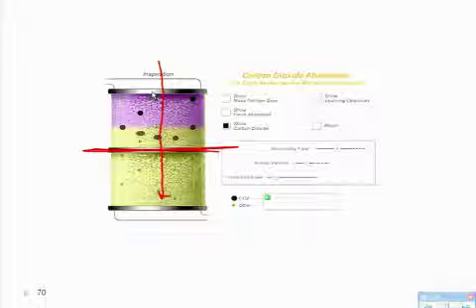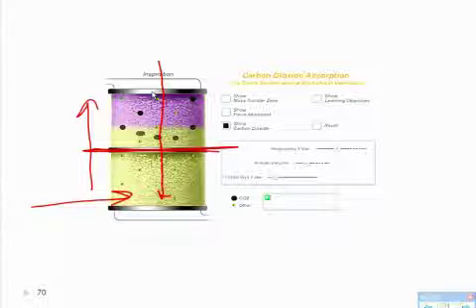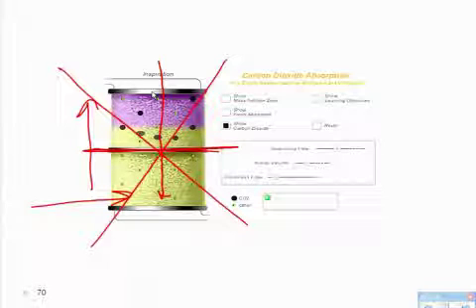However, some policies, some places that you go to work will say, if you're using one as a dual canister system, if you replace the top one and it's still in the middle of the week, it's not Monday morning, then you're going to elevate this one to the top and you're simply going to replace the bottom one. Okay, and that's acceptable. But on Monday morning, you get rid of both of them and you put two brand new ones in. Okay?